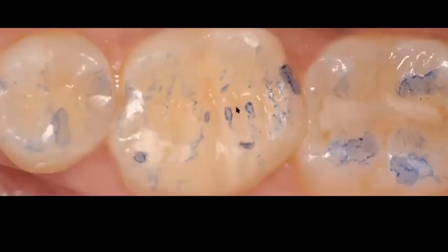So I have incorporated my restoration, my composite, into this occlusal system so that it is part of it. And I don't worry about wear. I know that I'm going to get wear. I know this composite is not going to last forever, like nothing in the patient's mouth will last forever. But I know that it's going to behave properly because I have been able to share the load between the composite and the tooth in a way that the load is evenly distributed. And I tried as much as I could to have no occlusal contacts in the areas in my margin area, so in the interface between the composite and the actual tooth structure.